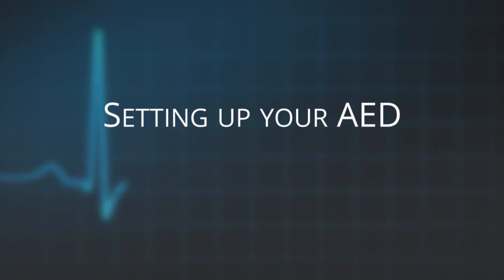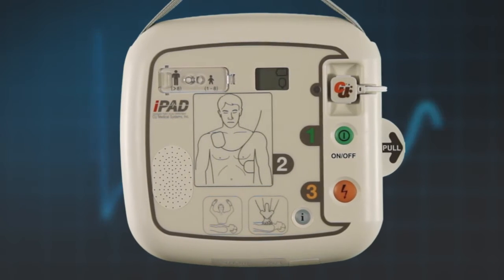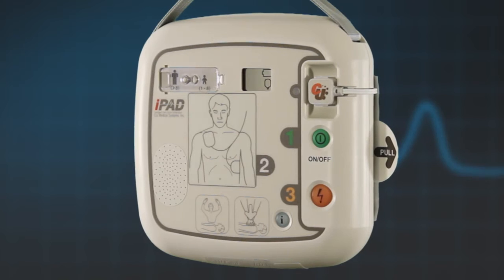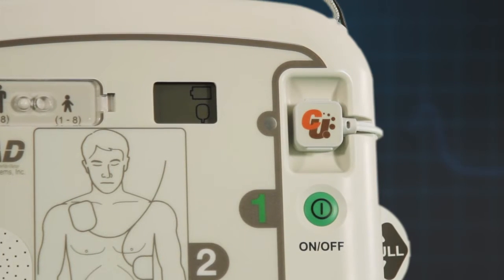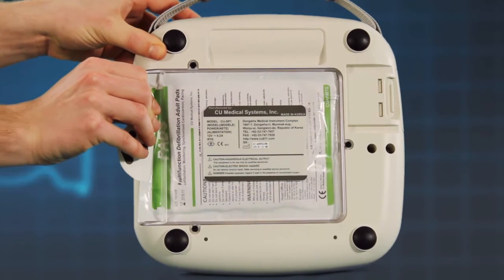This section will show you how to unpack your AED and ensure it is ready for use. After you have removed your iPad SP1 AED out of its box, the first thing to check is that the electrode pad lead is pre-connected to the front of the AED, and the electrode pads are firmly in the pad storage compartment on the back of the AED.